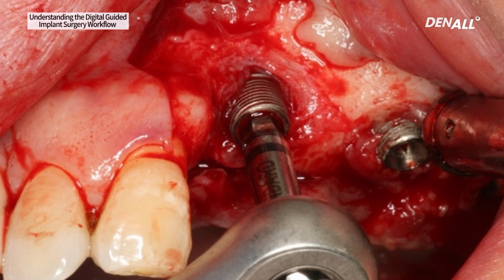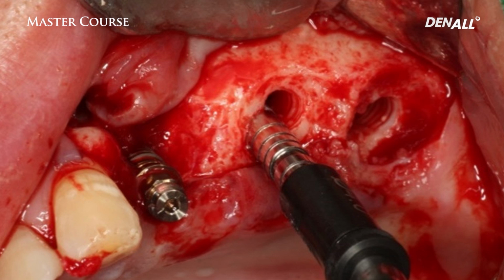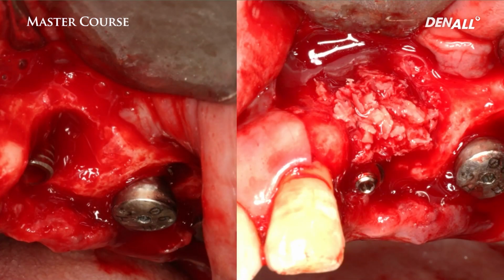If it is not easy, an EFR kit can be used. But fortunately, in this patient, we could use the implant driver included in the conventional taper kit. We used it in the reverse direction and the implants were removed. Drilling was done palatally to correct the malpositioned implants and new ones were placed.